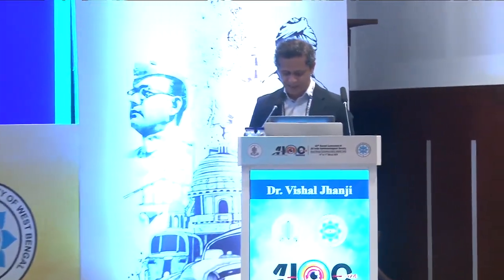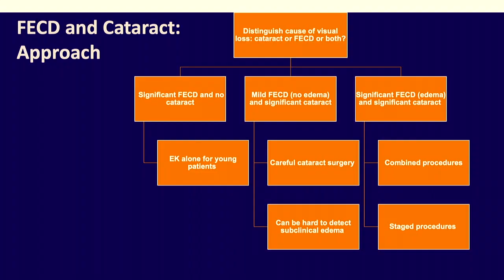So, we're going to take it further. We're going to discuss triple versus staged EK. Let's revisit the debate. Clearly it hasn't been answered. So clearly there's no consensus on whether to stage or combine EK with cataract surgery in patients who present with cataracts and Fuchs or bullous keratopathy.